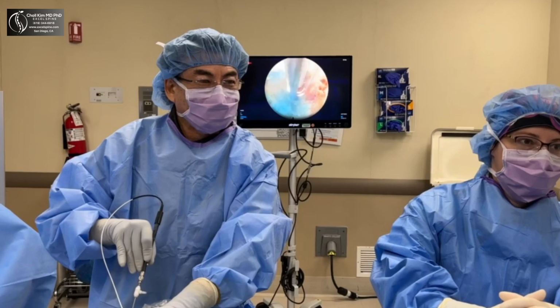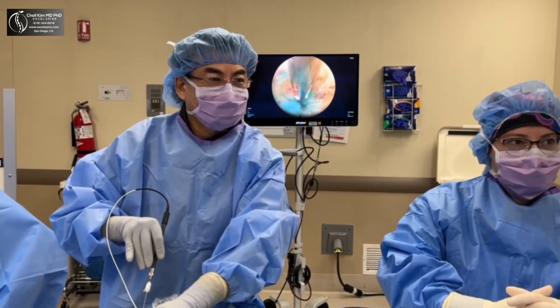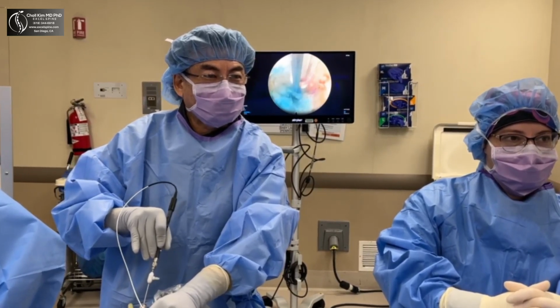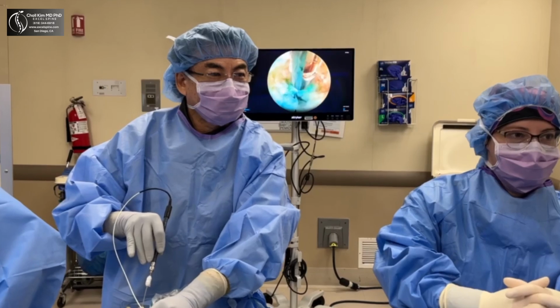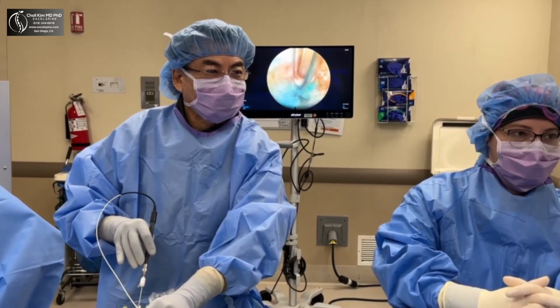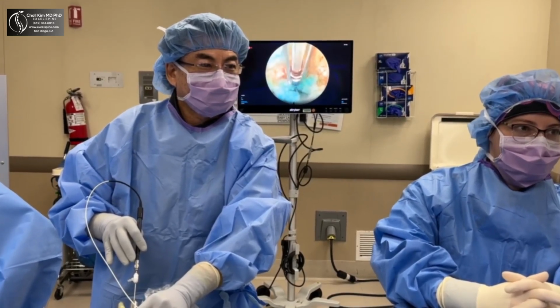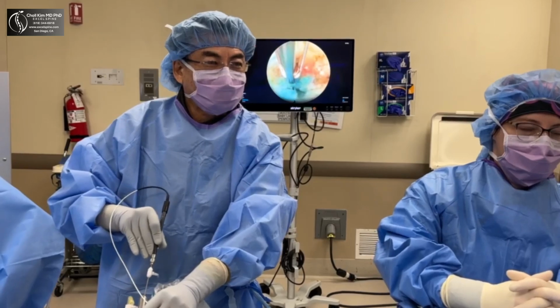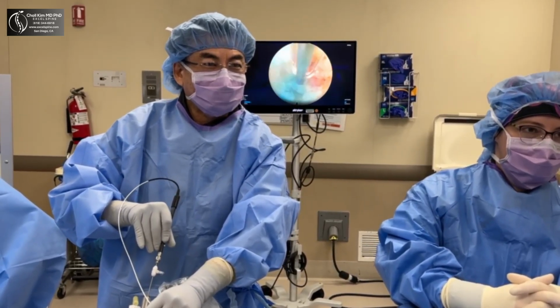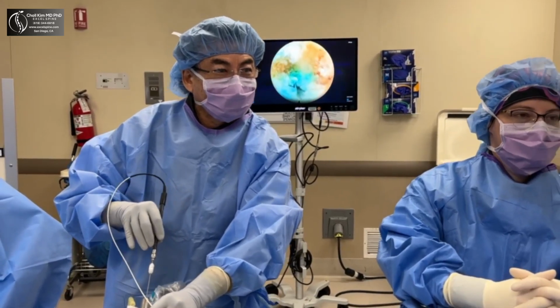You have like a little fissure that goes straight up. I wouldn't be surprised if something comes flying out of here. I may have to give it a little push though, like a pimple popper. Look how awesome the laser is. It's so gentle, so precise. Otherwise, I'd have to take a mechanical instrument and scrape that.